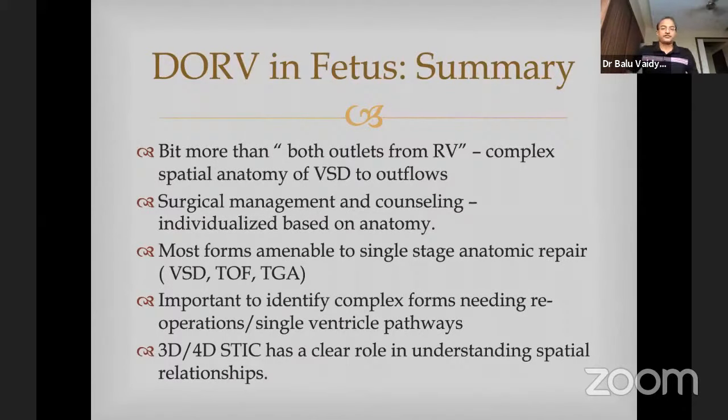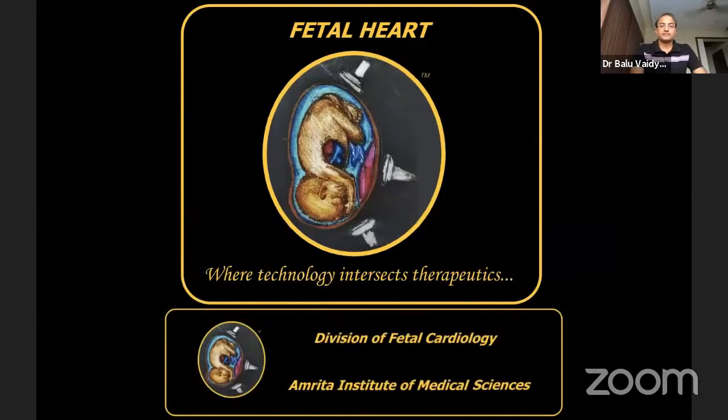And this is where I very strongly, I'm convinced now that 3D, 4D STIC has a clear role in understanding these anatomical relationships. So thank you so much.